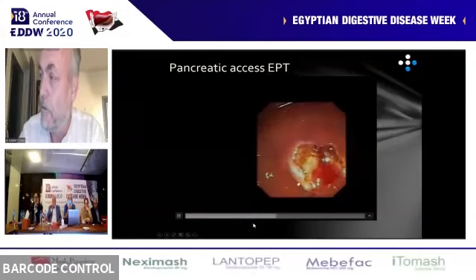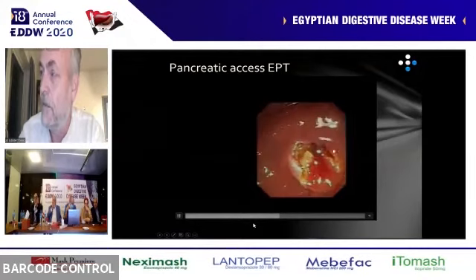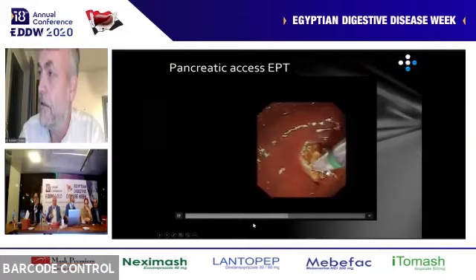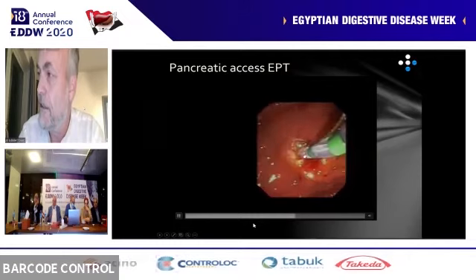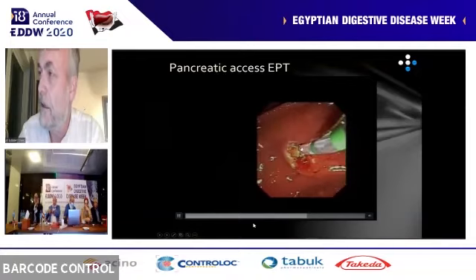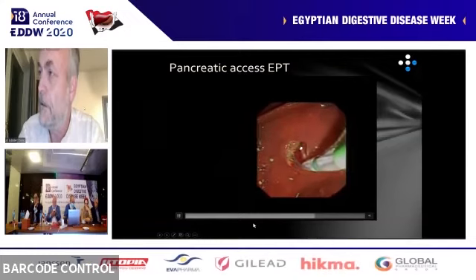And so when you get a little bit used to understanding the anatomy of this pre-cut visualization, you can realize that this is the place where the orifice of the bile duct is, and getting your guide wire out and in the right direction, you can slip inside.